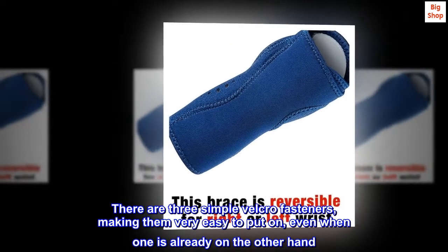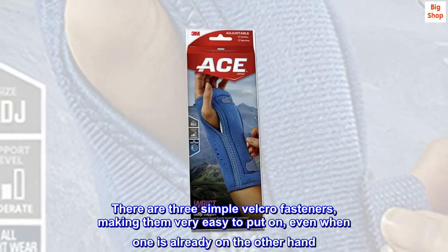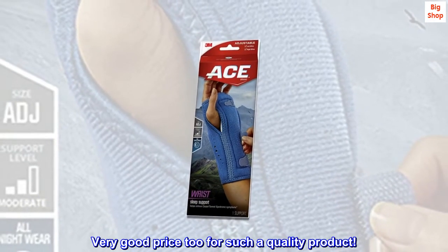There are three simple Velcro fasteners, making them very easy to put on, even when one is already on the other hand. Very good price too for such a quality product.